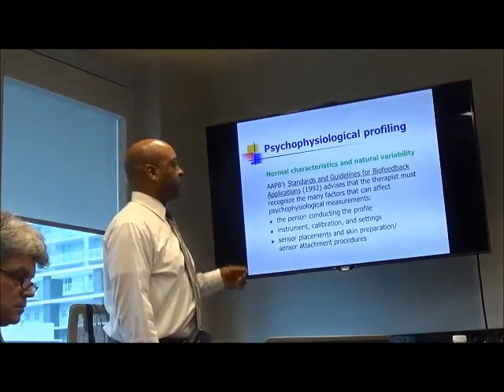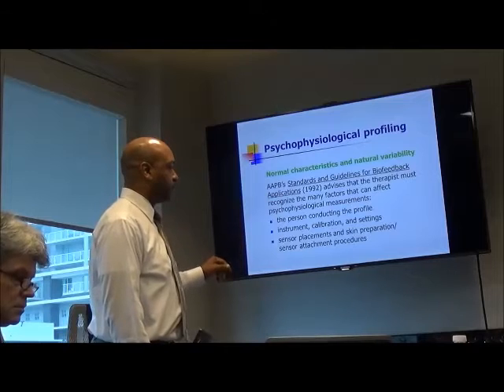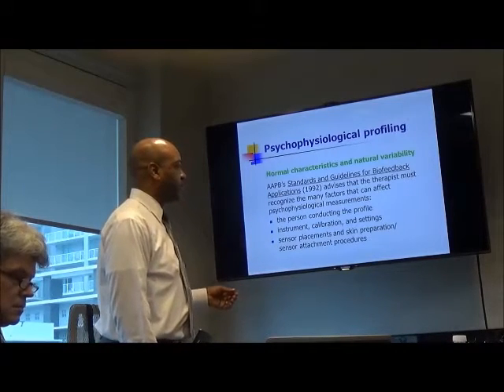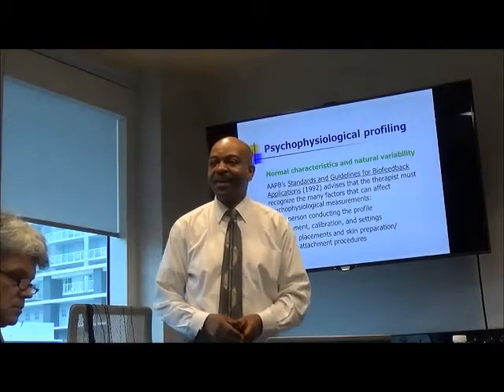So these are some things that you want to consider that are important when you're doing a stress assessment. The person that's conducting the profile, we talked about the person effect yesterday.